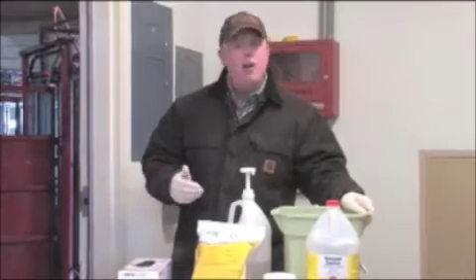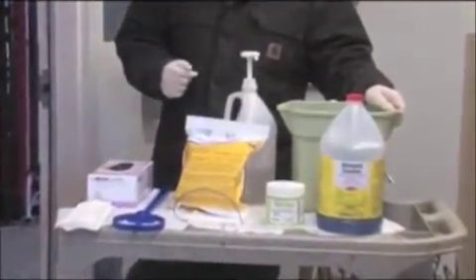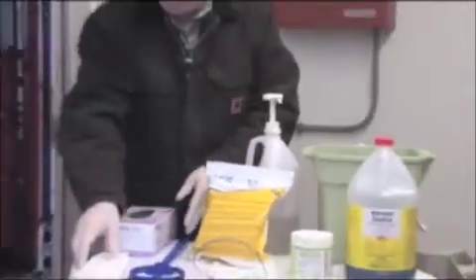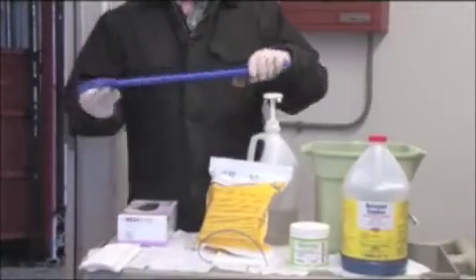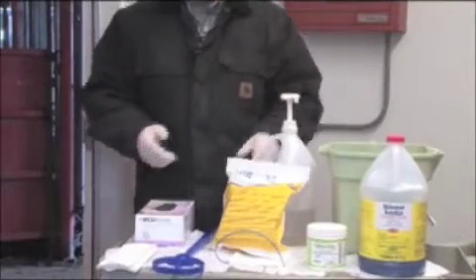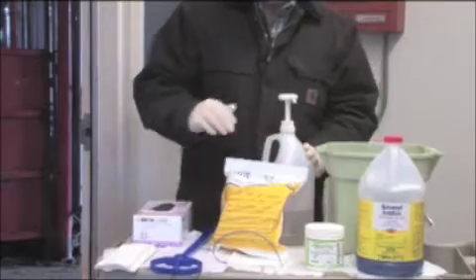Laid out before you are the materials you'll need to properly insert a CIDR into a beef cow or a beef heifer. These items include latex gloves, paper towels, the CIDR insertion device or CIDR insertion gun, lubrication, preferably a non-spermicidal lubricant.